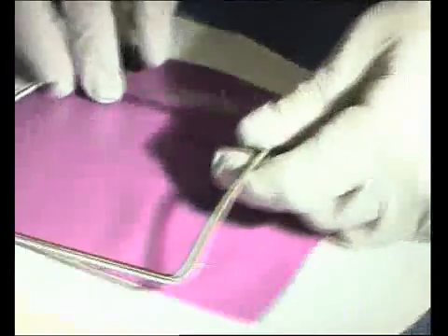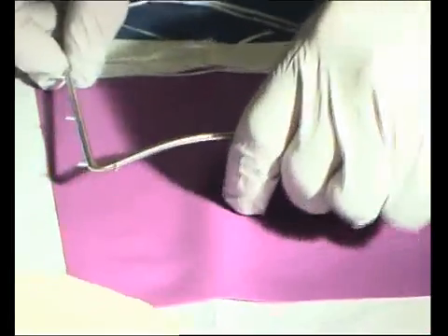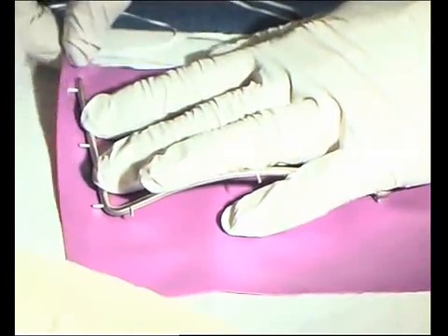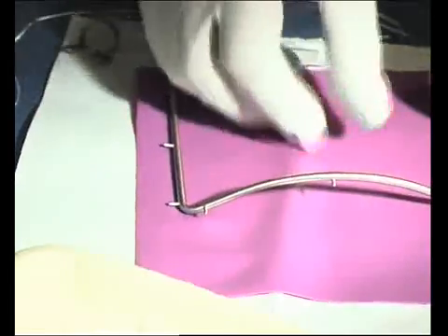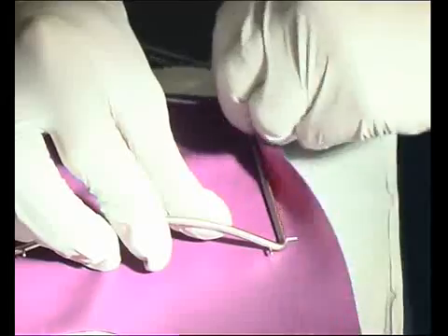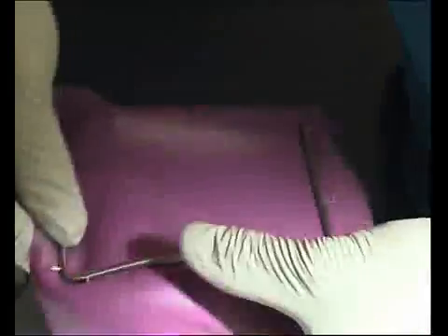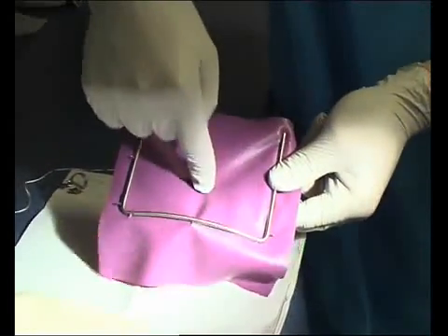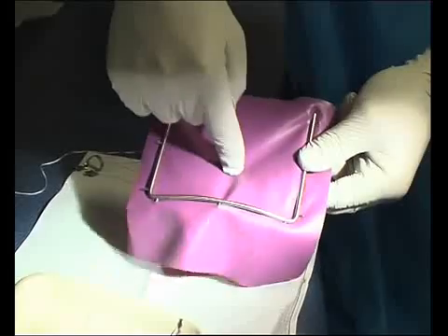Next thing is, this is the direct method. We're going to put the rubber dam onto the frame before we begin. So that's all attached on there. Now if we're going to place this on the lower left molar, the most flexible part of the rubber dam is here in the centre — this is ideally where the holes would be.